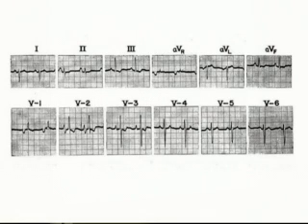Automatically we're thinking RVH, so we go down to V1. Indeed, it's all R wave. We go to V6, the S is deeper than R. So I've got very good evidence of right ventricular hypertrophy. Repolarization abnormality, V1 and V2, indeed that's present. So I can swing a gavel.